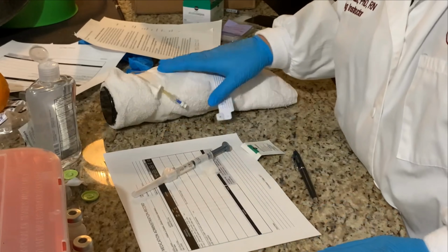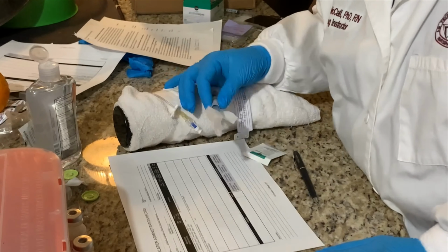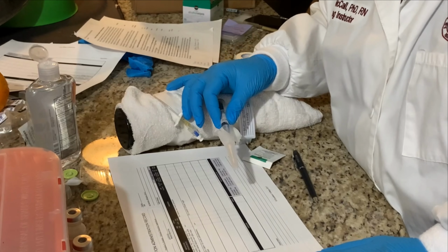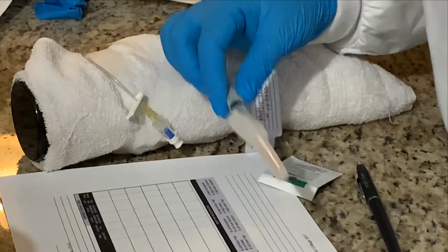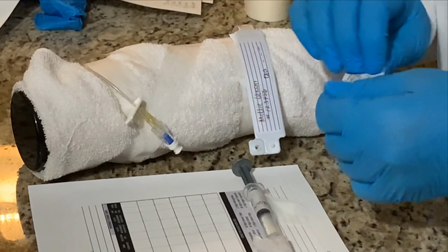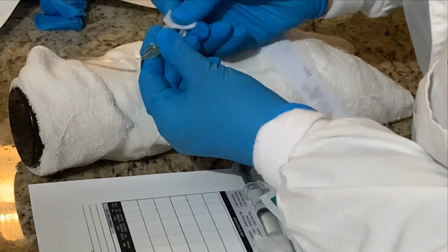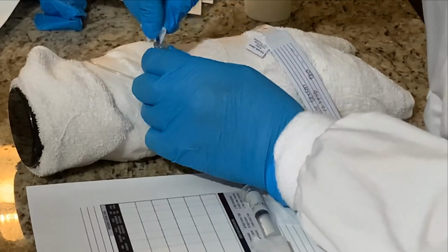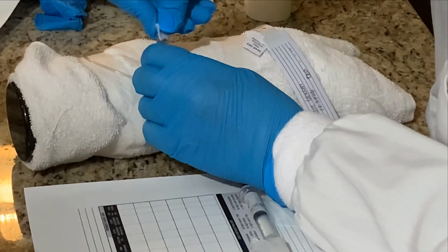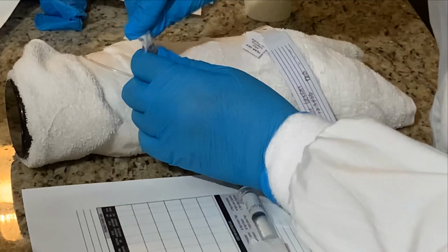Next, I want to give her an IV push medication, which is furosemide. I've looked this up. I'm going to be giving it over 2 minutes, and that's per your Davis drug guide. So the first thing I'm going to do is I'm going to clean this for about 10 to 15 seconds. And I'm scrubbing this like I'm juicing an orange, squeezing, rubbing along the sides and the top.